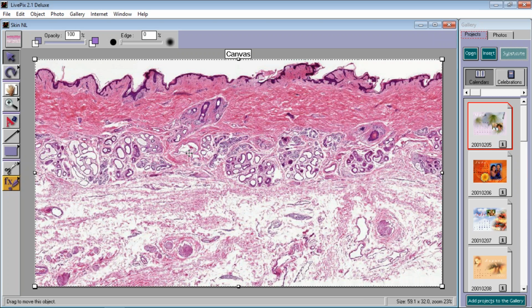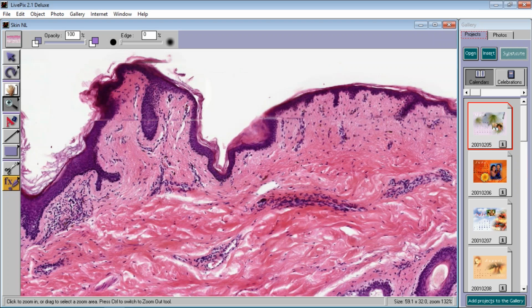And not only can you see the eccrine sweat glands, but you can see these larger sweat glands called the apocrine sweat glands. Because you have apocrine sweat glands only in places like your armpit and your groin, this was either from an axilla or a groin. And if you don't believe me, let's take a look, first of all, at the easy part.